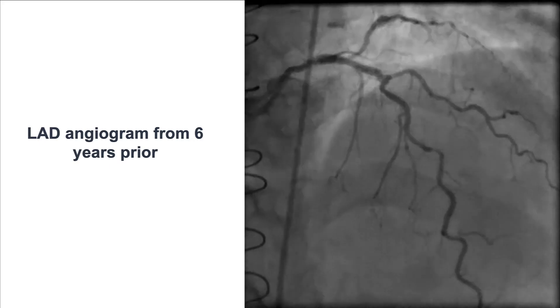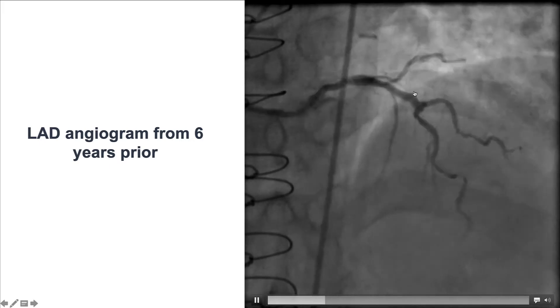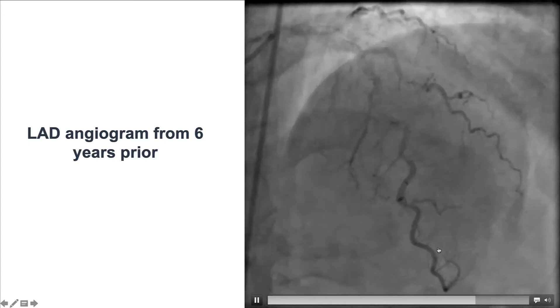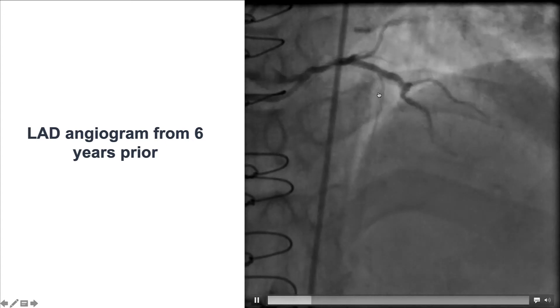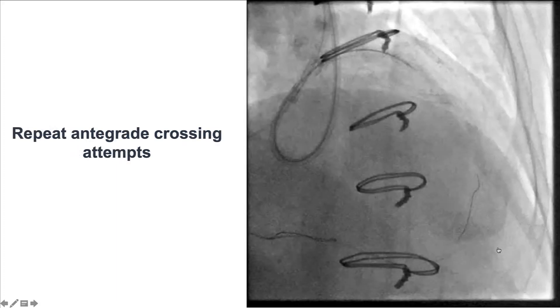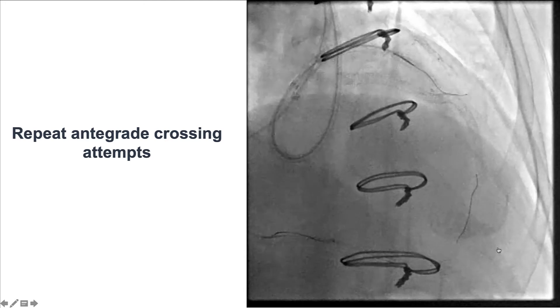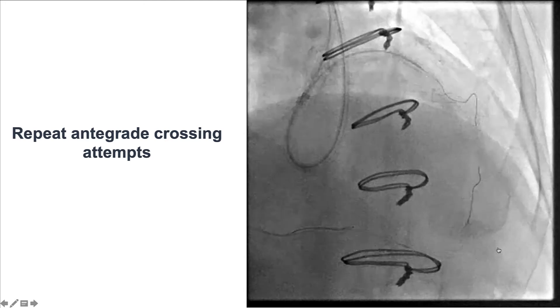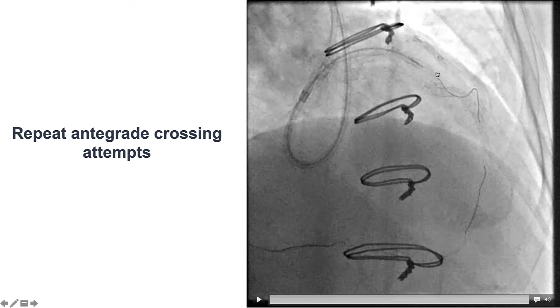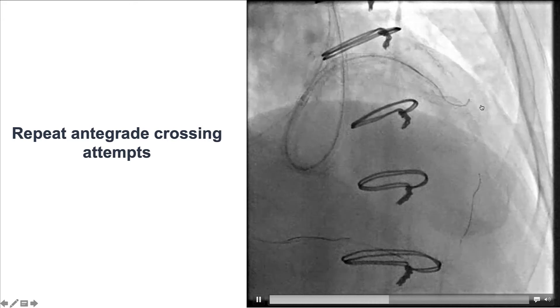In the meantime, we reviewed previous angiograms from six years prior showing the course of the LAD when it was still patent. We could appreciate the significant tortuosity of the vessel. Based on this angiogram, we performed more antegrade injections through the microcatheter and were able to appreciate that the vessel was coursing superiorly and then downward — highly tortuous, as suggested by the previous angiogram.